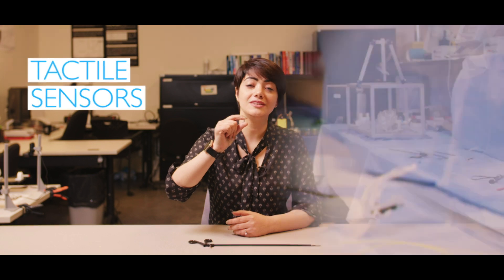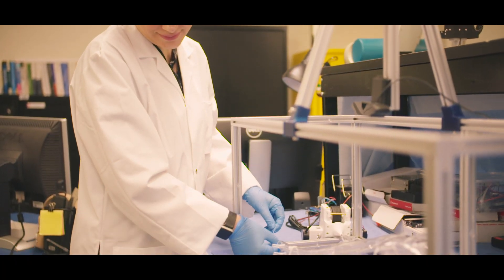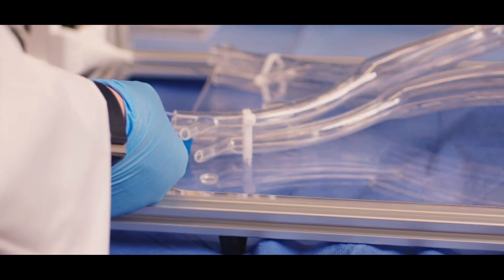To this end, I developed various tiny tactile sensors to be installed at the tip of surgical instruments. I used optics and laser principles to design these sensors and utilized 3D printing technology for precise fabrication.